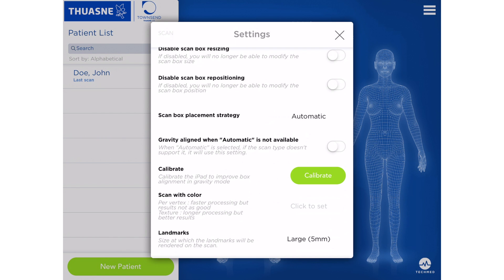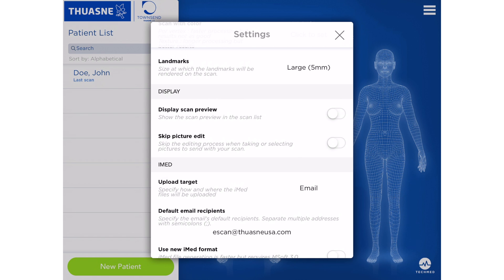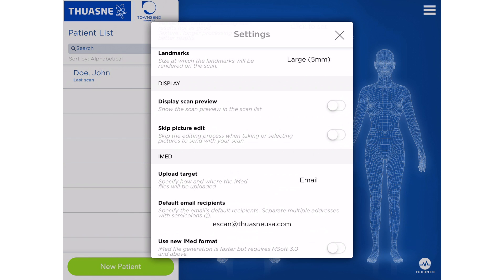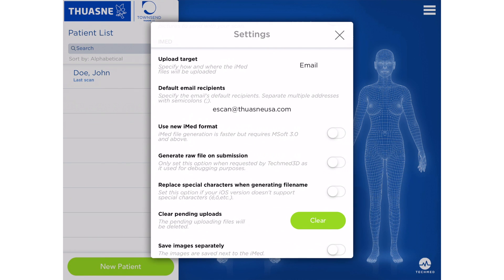Once the ScanBox Placement Strategy has been set to Automatic, scroll down further to the option of Upload Target. Here, you'll need to define email as your method of file uploading. When this has been established, drop directly below to Default Email Recipients and input your designated email recipient: escan at thuasneusa.com.